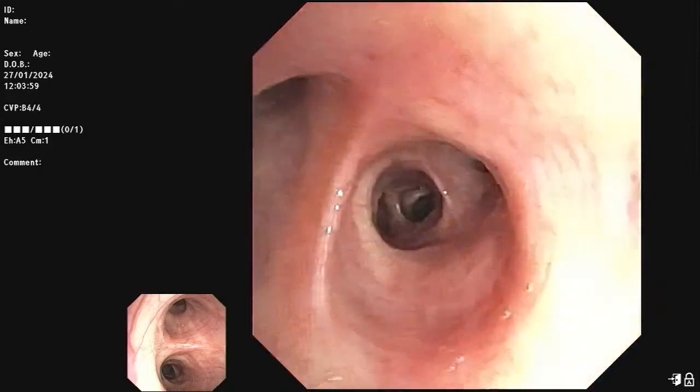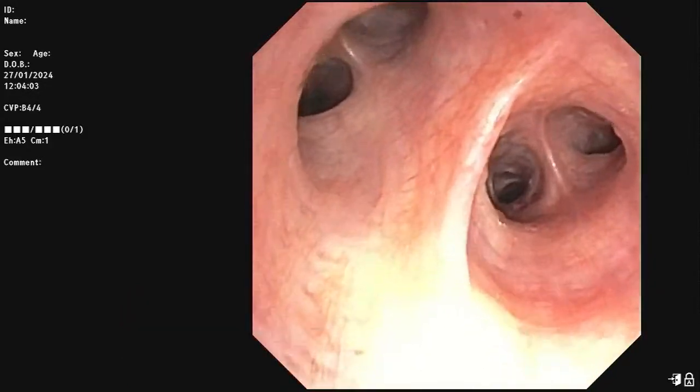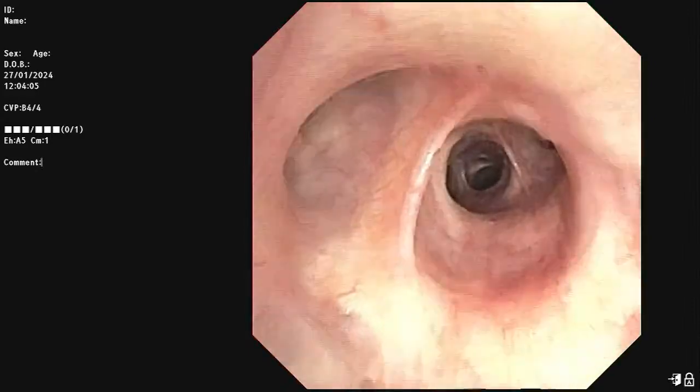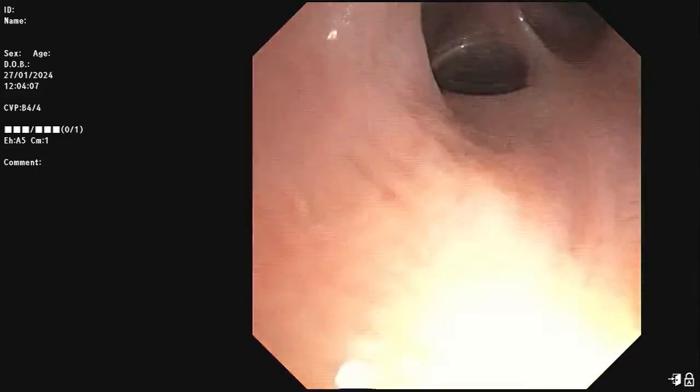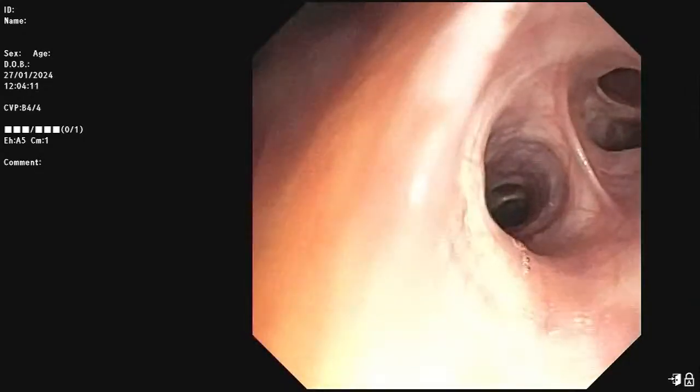Right, doctor? It's coming, you see the two segments? Seeing all three immediately. The apical is inside the anterior. Yeah. That's the posterior segment, but you can see it looks all normal.